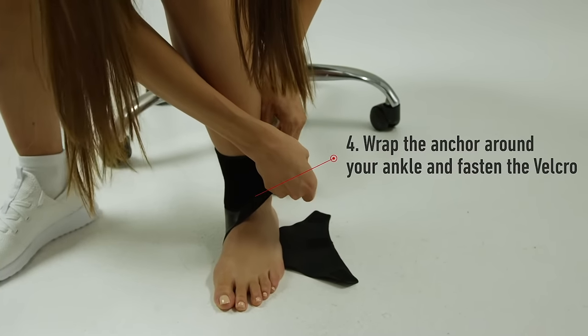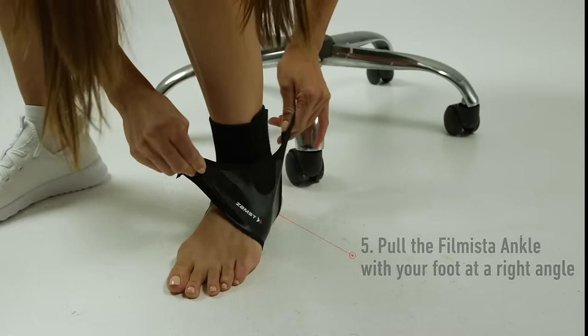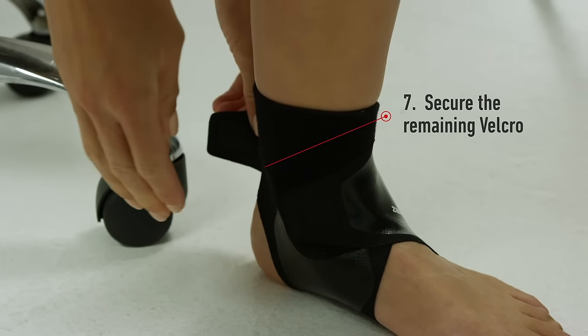Wrap the anchor part around your ankle and fasten the Velcro. Pull the filmista ankle with your foot at a right angle. Pull the middle Velcro up and over the outer ankle bone and fasten. Secure the remaining Velcro to create a seamless closure.